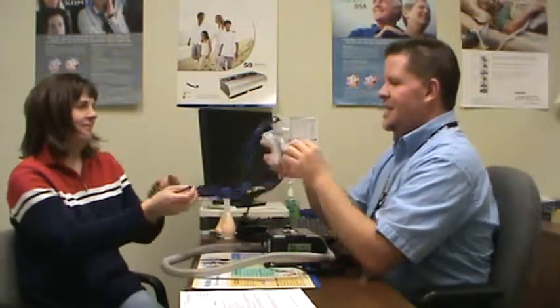Very good. It's going to take some time to be able to do this in bed, so I suggest that you stand in front of the mirror and practice. Feel the receptacle, feel the clasp going into the receptacle, and you'll get it down to a science. We're now going to attach the mask to you, get a good seal, hopefully, and see how it feels for you.